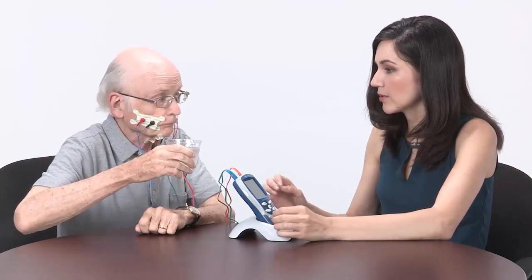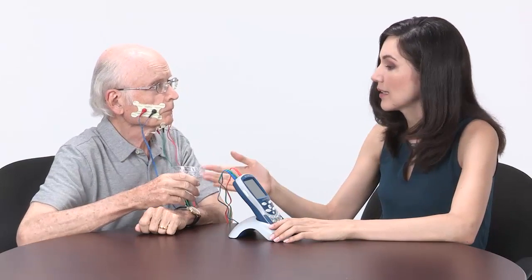The idea here is to have the device deliver stimulation in a sequence such that it starts in the top channels and then the bottom channel. The therapist will instruct the patient to get ready, take a sip, squeeze hard, and swallow strong.